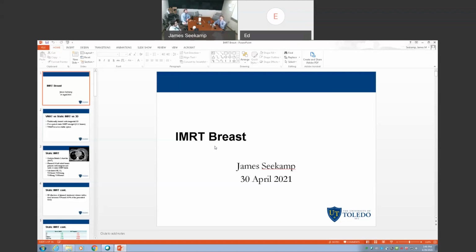And one way we found that we could do that is if we create a contour that is maybe like a cork structure around, and find out whether that gets dose, and then plot the 90% isodose line inside. So in the air around the breast or chest wall, place cork, calculate the 90% isodose line with the robustness. Now, if you do it with the fake bolus technique, you only have one number to worry about, right?